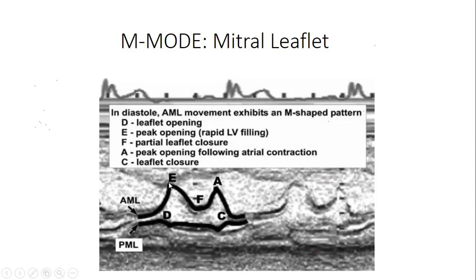When you put your M mode, this should not scare you. What is the E and what is the A? Remember, I asked, what are the phases of the diastolic phase? Okay, the catch is here. Please don't get confused. They are saying in diastole, not in systole. So in diastole, there are certain things that you need to have in mind.